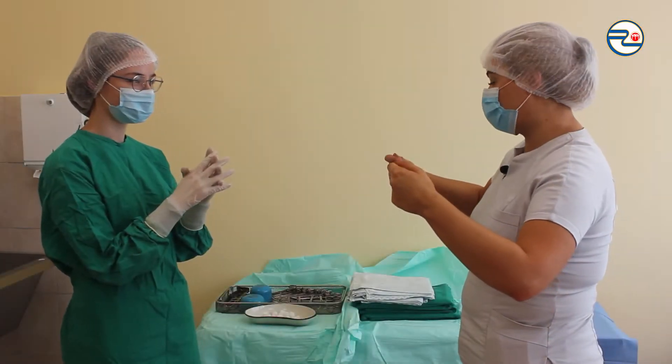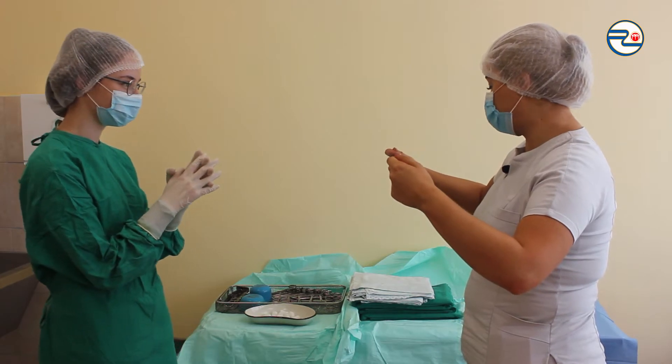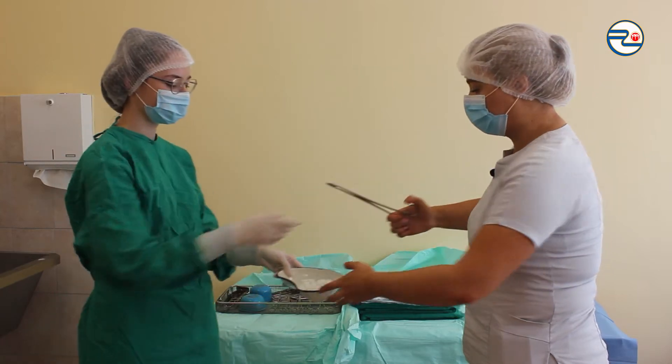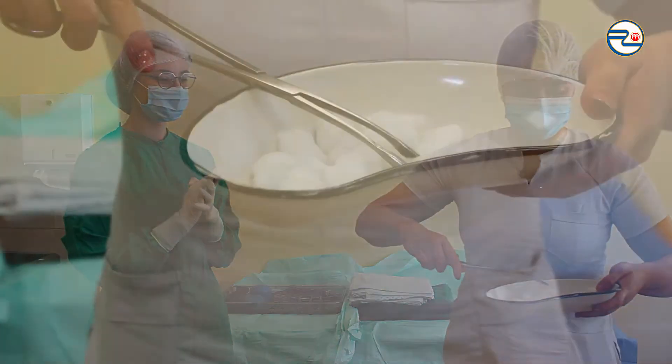Nurse, please give me a sterile bowl with antiseptic and gauzes and also a sterile instrument. I'm keeping my hands far away from me, above my waist and bent through my elbows during the entire procedure.